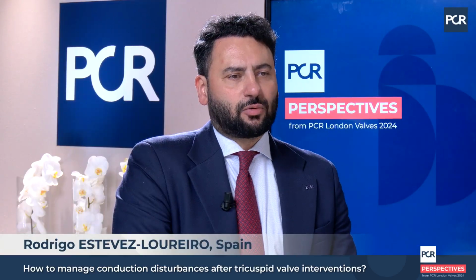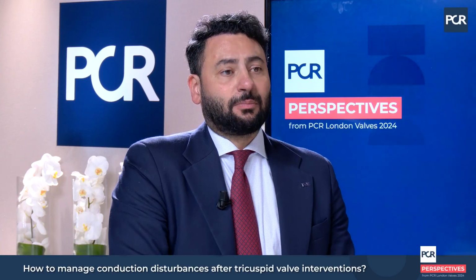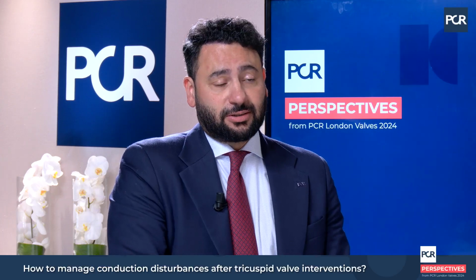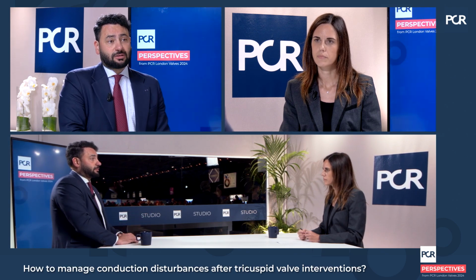Thank you, Marianna. This is a fantastic question, of course. So the mechanism is probably the mechanical pressure of the valve on the conduction system, which is in the interventricular septum. Of course, there are some design features of some valves that make this more frequent. Probably Evoque has this ventricular legs design that impacts more in some cases. In Evoque, it's not a matter of oversizing, but in other valves it could be a matter of oversizing of the valve relative to the size of the annulus. So you have to pay attention to those factors.